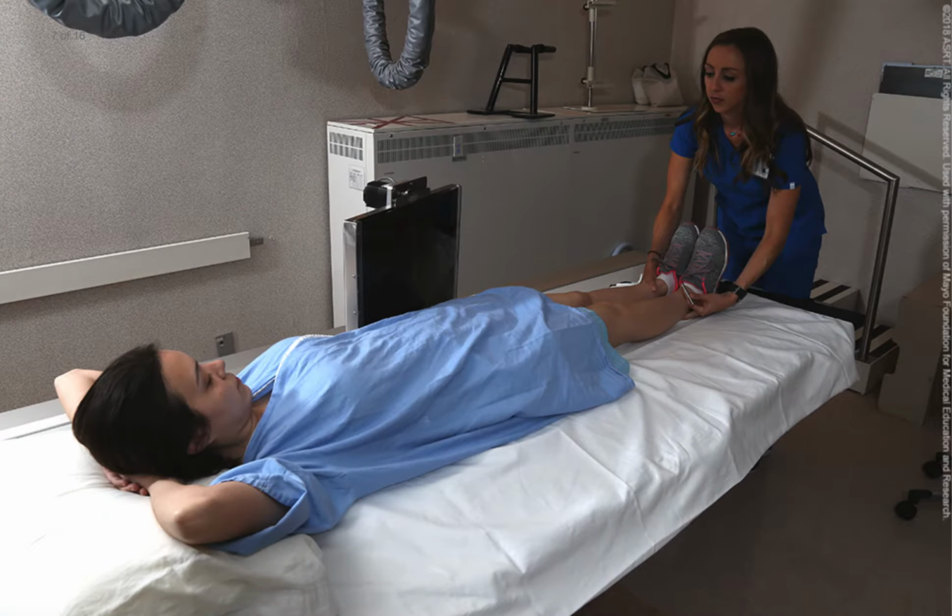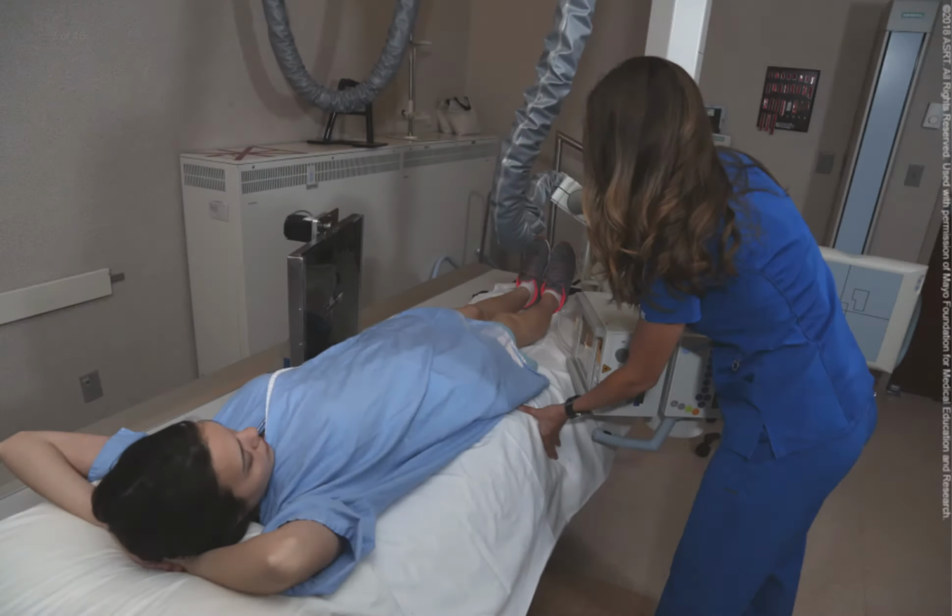Positioning for the axiolateral or cross-table lateral projection begins with the patient lying supine on the radiographic table or stretcher with the affected limb extended. Have the patient place their arms in a comfortable position outside the field of view. The patient's pelvis might need to be elevated using a positioning cushion or folded sheets so that the most prominent point of the greater trochanter can be centered to the midline of the image receptor.